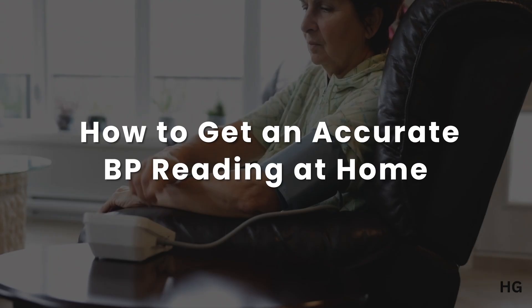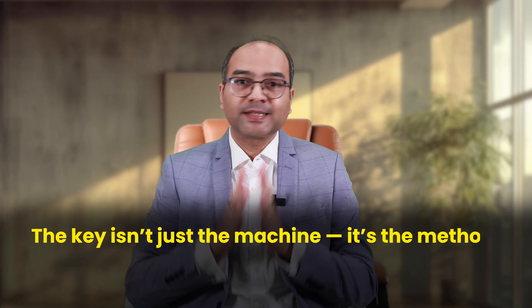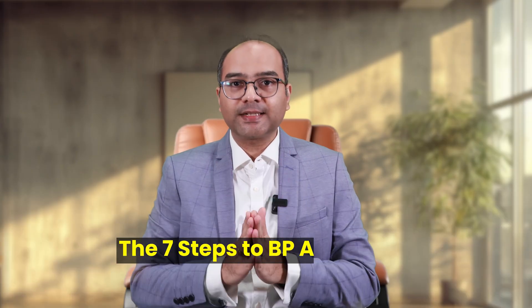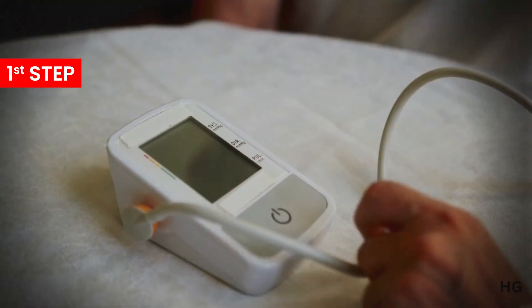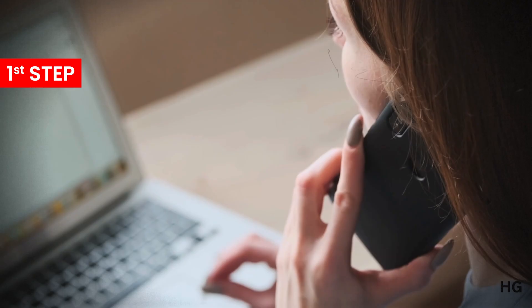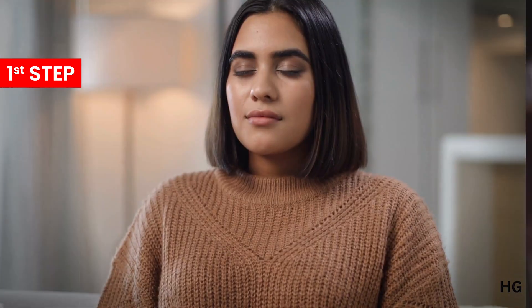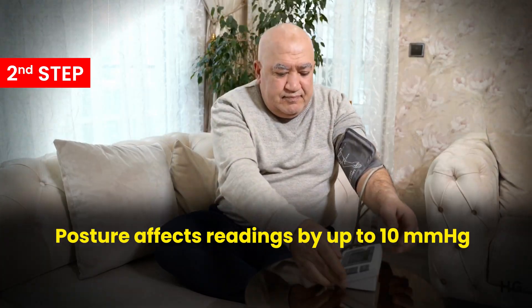Now that we know what machine to use, let's understand how to use it best. The key isn't the machine — it's the method. Here's the tested 7-step method. First, before you even press the on button, sit calmly for 5 minutes. No phone, no chai, no coffee, no multitasking — just breathe. Second, sit straight on a chair with your back supported, legs uncrossed, and feet flat on the floor. No slouching or crossing legs. Posture affects readings by up to 10 mmHg.